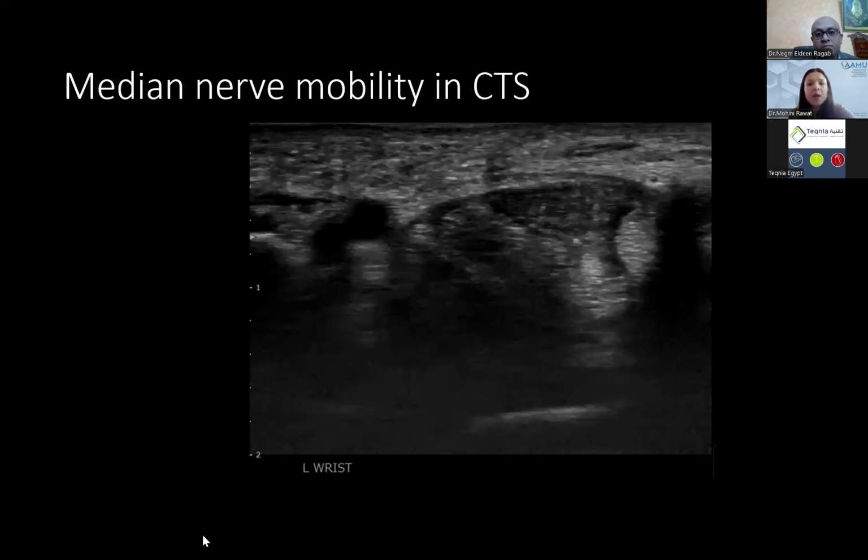Good question. So nerve ultrasound can be used. If you say often, I would say whenever you have a suspicion of nerve injury, ultrasound can be used. Now, injury can be different, there are different definitions of injury, but peripheral nerve is so easily accessible with ultrasound that I would use it in every case if there is an indication. So that speaks to the first question that you asked.